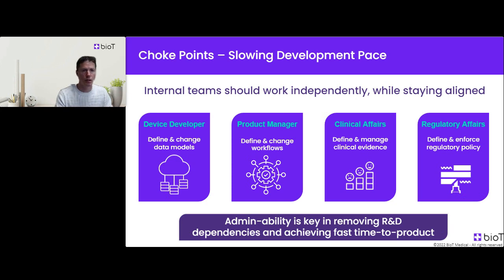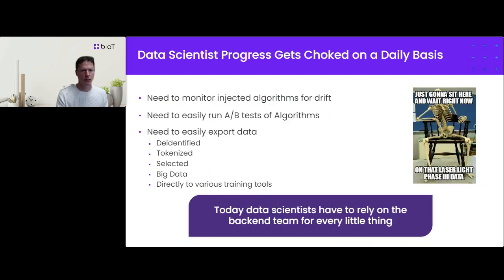There is another special kind of user, which is very much the reason for all of that. It's the data scientists, the people who provide those algorithms that analyze the raw data and create those new insights and new biomarkers based on signals that never existed before. So actually, these guys, how do they create their algorithm? It's just the end result of their work. First, they had to get data from the system. Then after they provided an algorithm, it's only version 1.